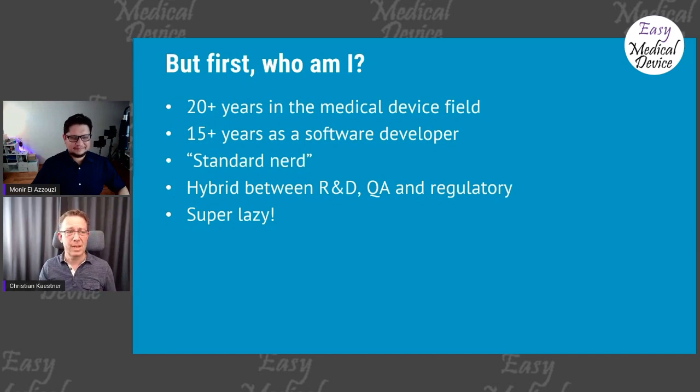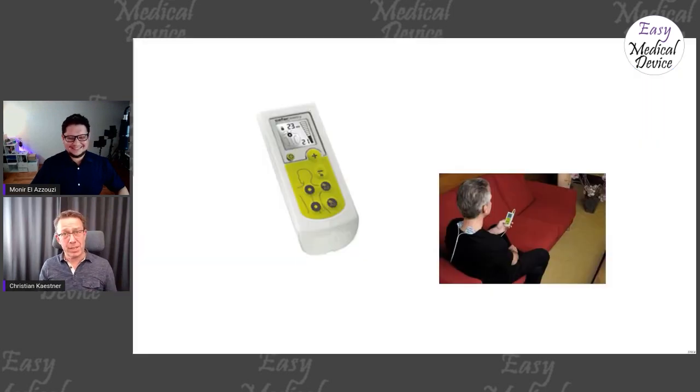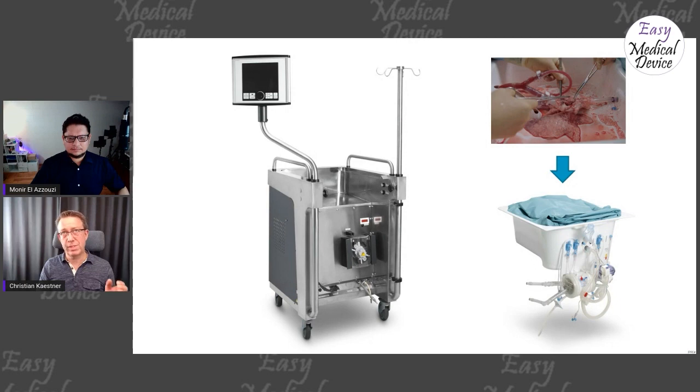Yeah, agree. So I like to be lazy. A couple of products I've been working with. I've been working with TENS, that's muscle stimulation for pain relief, so you can relax muscles. I've been developing embedded software for these products, a whole range. I've been working with devices used to evaluate lungs before transplantation. So you take a lung from a donor, you place it in this white box, and then you can test if the lung works.